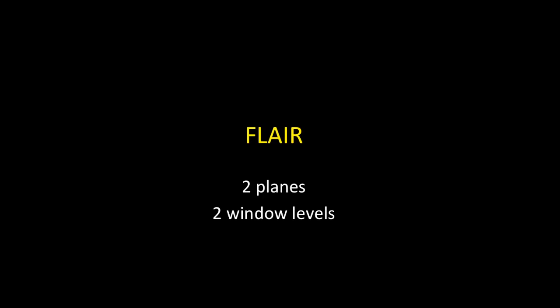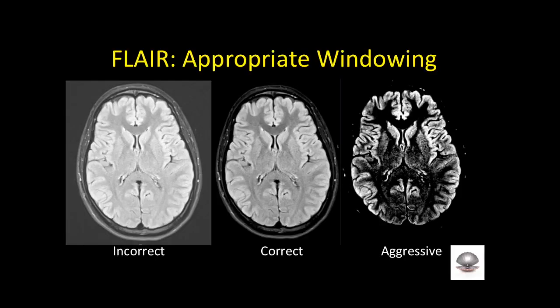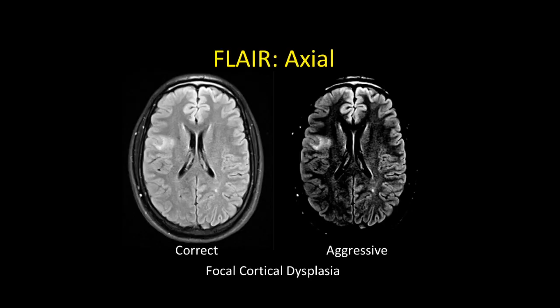Moving to FLAIR — axial and coronal at two window setting levels. Sometimes the tech sends over FLAIR at an inappropriate windowing level. You want to window it so the signal in air outside the brain is black and dark — that's the correct setting. Look at axial and coronal at that level. Then window it aggressively, suppressing white matter so only the cortex shows — a look similar to double inversion recovery without the acquisition time. Look at axial and coronal again at this aggressive setting, and cortical lesions should pop out.